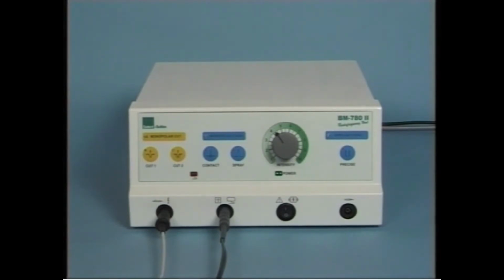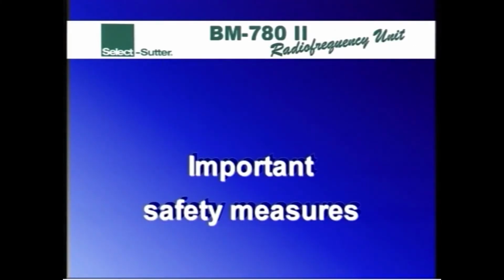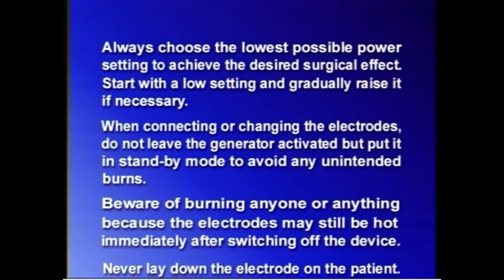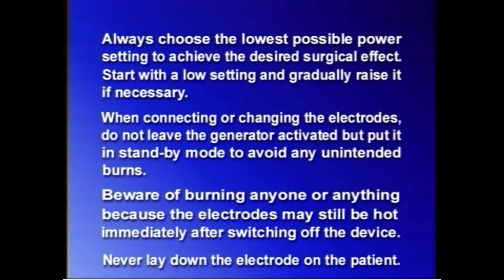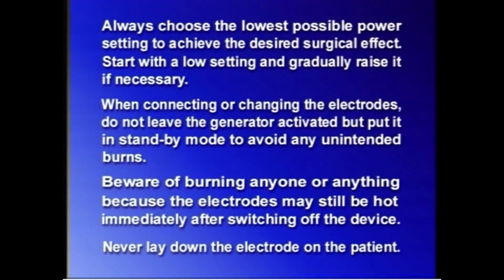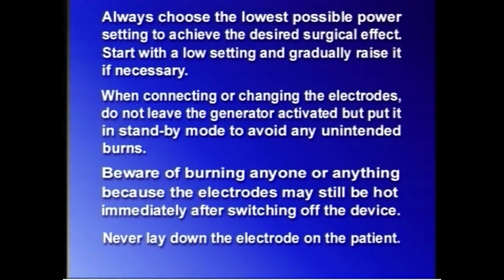Important safety measures. Always choose the lowest possible power setting to achieve the desired surgical effect. Start with a low setting and gradually raise it if necessary. When connecting or changing the electrodes, do not leave the generator activated, but put it in standby mode to avoid any unintended burns. Beware of burning anyone or anything because the electrodes may still be hot immediately after switching off the device. Never lay down the electrode on a patient.